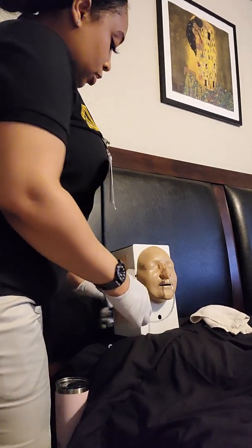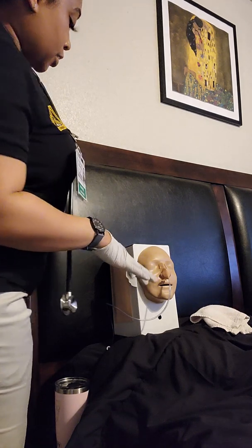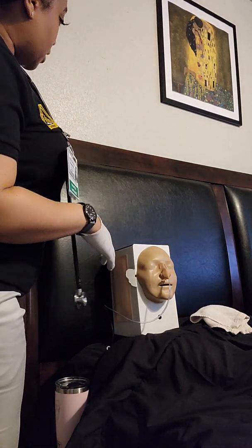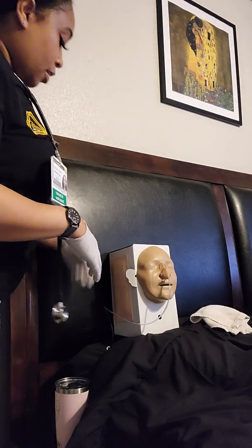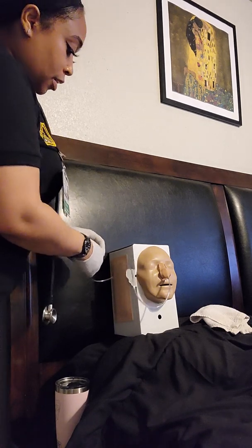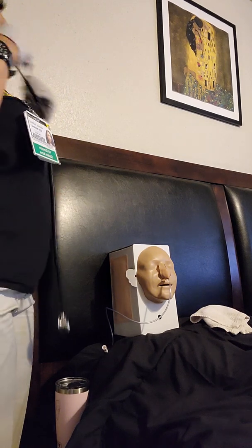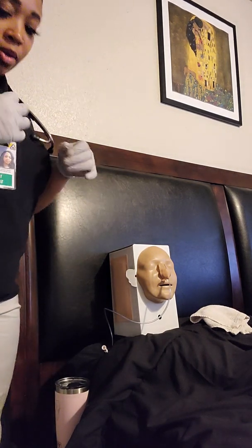All right, so the suction has already been set up prior to me inserting the tube. So I'm going to go ahead and put it at continuous suctioning, 60 to 80 millimeters mercury. Connect the tube and switch it over to intermittent suctioning, so that way we didn't have any issues with the suctioning continuing even if your stomach is empty, because that could create an ulcer.